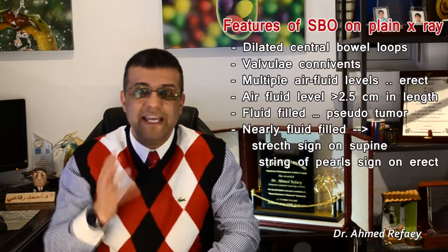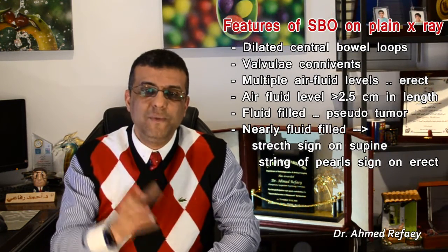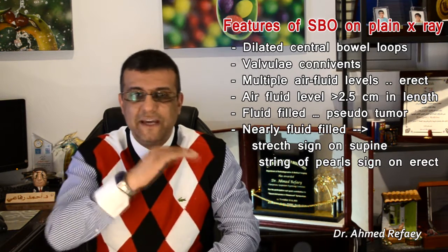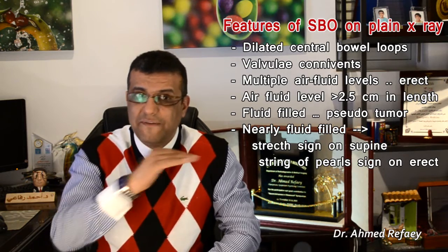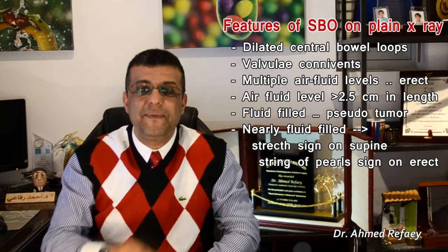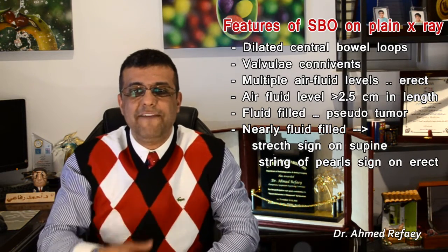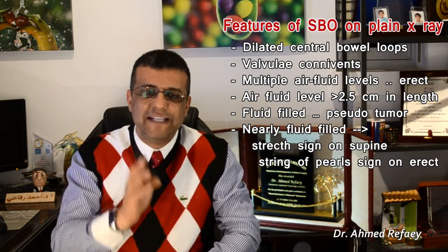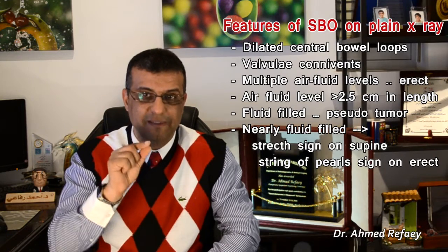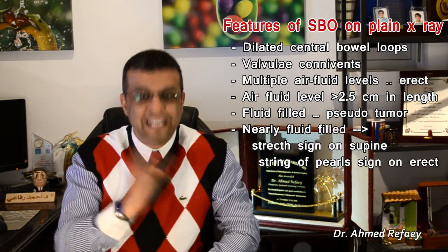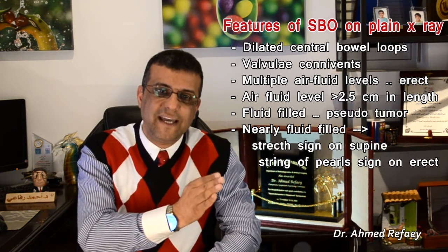Don't forget — the stretch sign and the string of beads sign are almost always indicative of small intestinal obstruction. To summarize the plain x-ray features of small bowel obstruction: dilated centrally located bowel loops with valvulae conniventes; multiple air-fluid levels on erect study, each more than 2.5 cm in length; pseudotumor sign in fluid-filled dilated loops; and stretch sign on supine or string of beads sign on erect radiograph when small air bubbles are trapped between the valvulae conniventes.